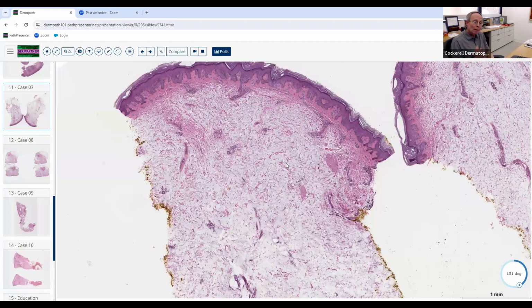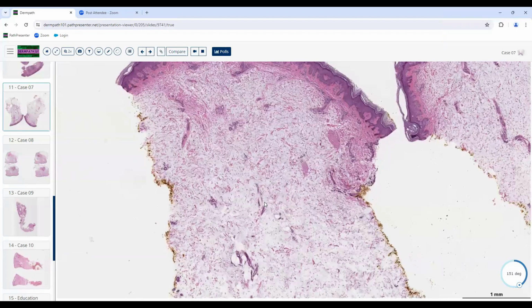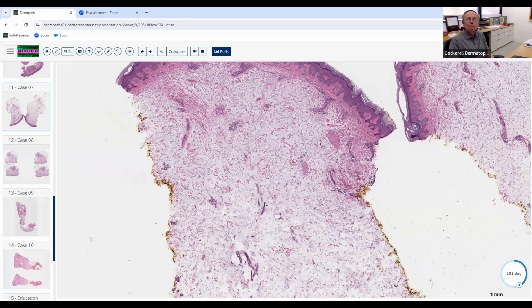But there are a couple of other diseases. Lupus erythematosus. There's a type of massive cutaneous mucinosis that can be seen in SLE. Sometimes your biopsy looks just like this, interestingly enough, and sometimes dermatomyositis. You'll see these patients come in with a big boggy lower eyelid that looks like it's bullous, and you biopsy that, and it's got tons of mucin in there.